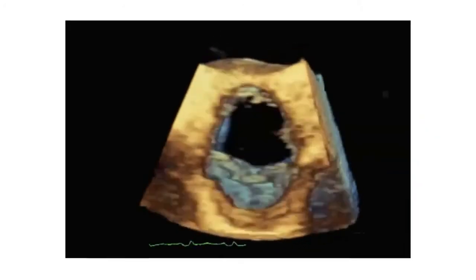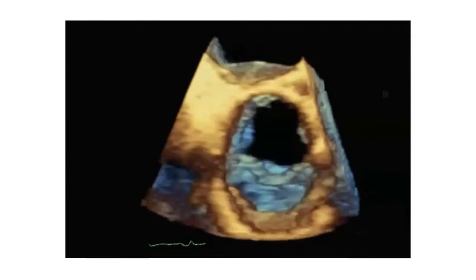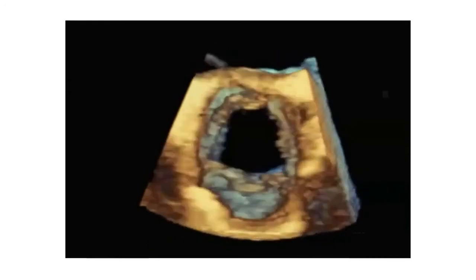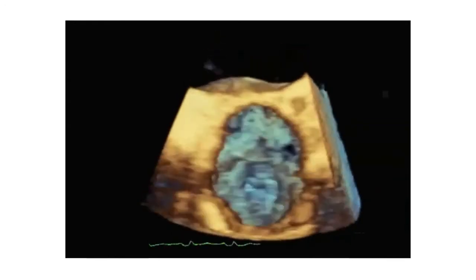So actually, I think this is really amazing what echo can give us in advanced course. Yeah, I think it's just fascinating what this technique is able to do. Of course, this is something that you will maybe learn in the future courses that you might visit. But at this point, important for you is just to understand that the aortic valve is still a 3-dimensional structure. And when you image, you have to be aware of this and always scan back and forth so that you have the entire aortic valve in your field of view. That way, you will be much more sensitive with respect to diagnosing, for example, aortic stenosis or actually any pathology.